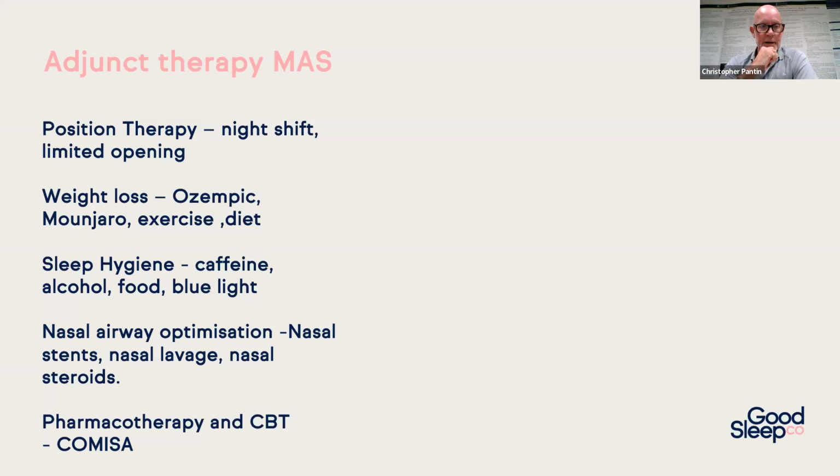So this comes to splint design, and there certainly is at least one study by Francesca Milano out of Bologna. We were always suspicious, especially with appliances that don't have any limit to their opening, that was a negative thing. And thank God she did a study in 2015 that showed that's right. So if you're using any appliances that don't use elastic to limit opening, you should reconsider that, especially in supine. Her study was more looking at supine sleepers and the effect of using elastics by limiting the opening.